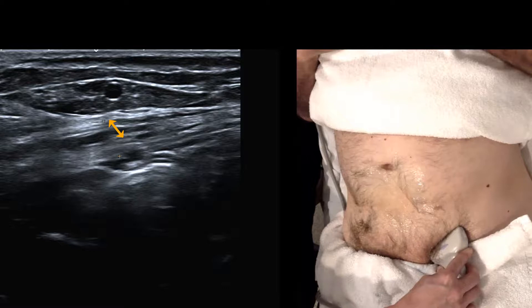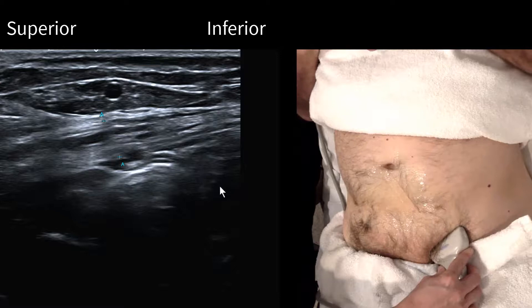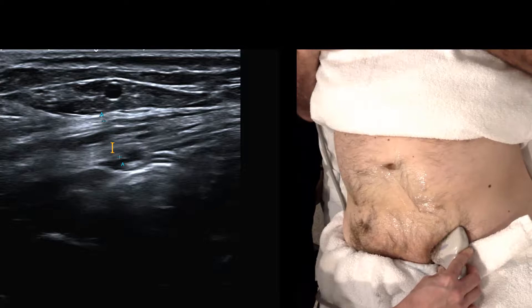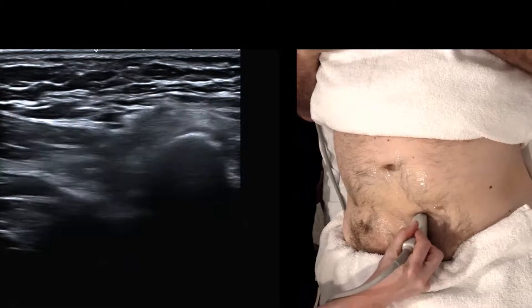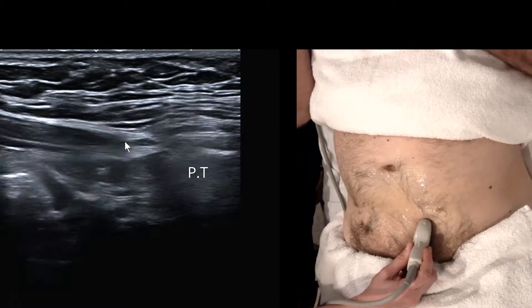On repeated slow gradual strain and relax, the deep ring is not actually changing - it's not increasing over ten millimeters. But there's plenty of movement just distal to the deep ring, so there's definitely a hernia present. In this case it's not entering via the deep ring, so it's probably going to be a direct hernia. To diagnose a direct hernia, start with exactly the same landmark: rectus abdominis, pubic tubercle, move immediately laterally to the region of the conjoint tendon - we can see a gap here which is the superficial ring.